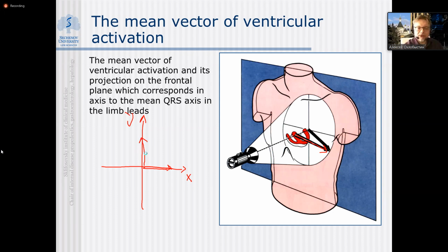If you get projections like that, we presume the vector will be in the upper right quadrant. If you get a positive projection over the x axis and a negative one over the y axis, that may be the position of the vector you're looking for.